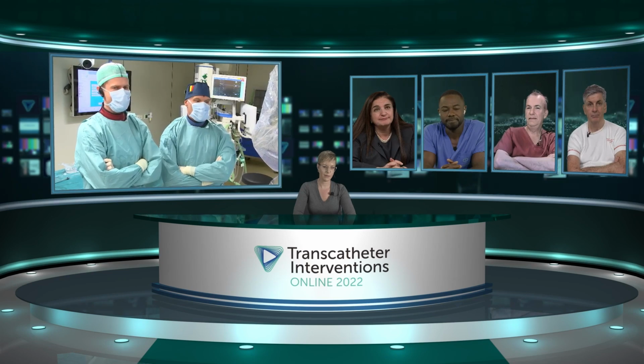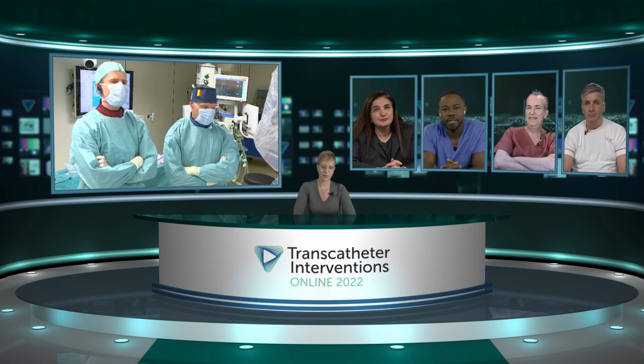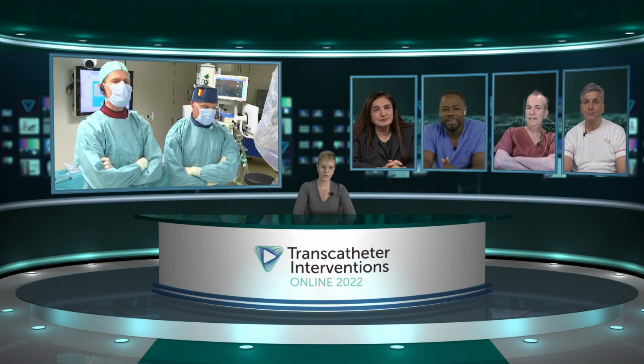So, Didier, what do you think? So this is definitely an extremely challenging patient, but I really recognize your selection, and I'm sure that you're going to handle this patient very nicely.